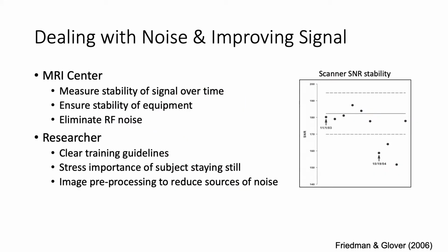And so, again, I say the first rule of quality assurance is to examine your data. Both while you're scanning and when you get the data set, you really want to look at it. You want to look at the actual images. Depending on what package you're used to, FSL, AFNI, SPM, there are ways to view the slices and volumes acquired over time, and you really want to review them to see if there's anything off in the way the data look.